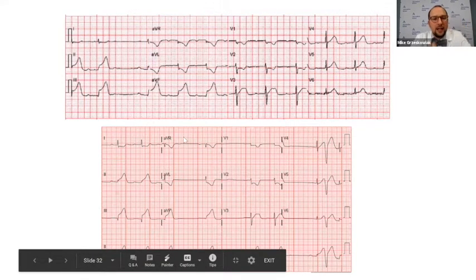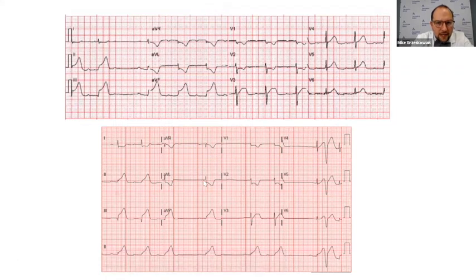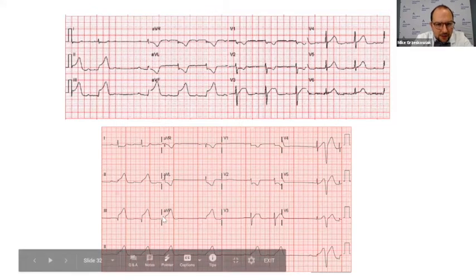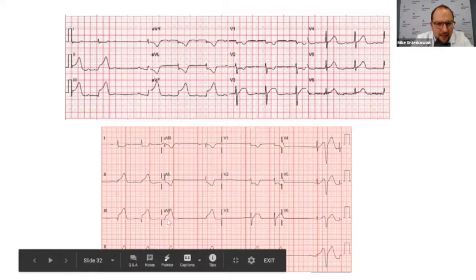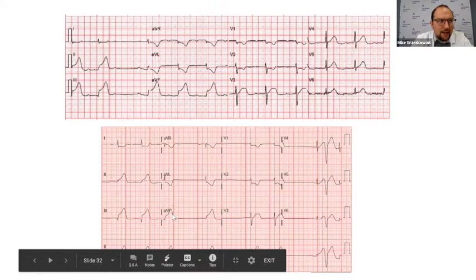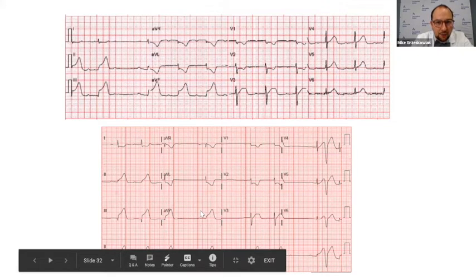Going to aVR, we see some T-wave inversions, but that's normal. In aVL, there are significant ST depressions. In aVF, there's significant ST elevation. So we know that the inferior leads — II, III, and aVF — all have ST elevation, meaning there's inferior wall ischemia.